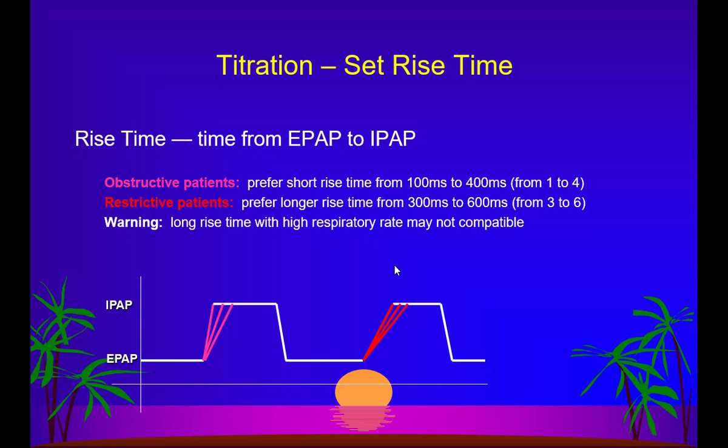In those cases, you can keep a little larger inspiratory time, so that enough time is achieved for the gas distribution of the pressure, so the tissues or the lung alveoli are adequately ventilated, right? But in a patient who is at a high rate, say 30, 40, like your ARDS patient, this rise time doesn't make any sense. The only sense it makes is in patients with COPD, where you want to set a smaller rise time. So that is the important thing that you have to remember.